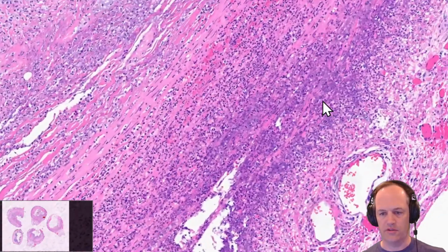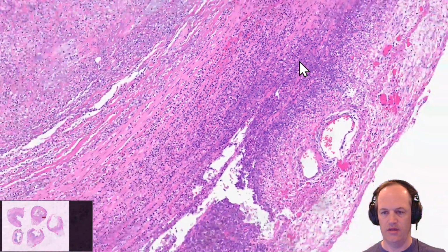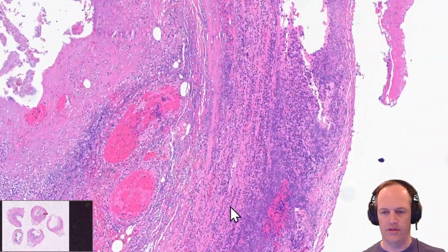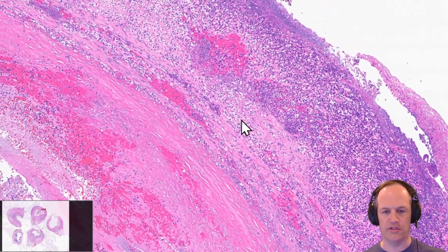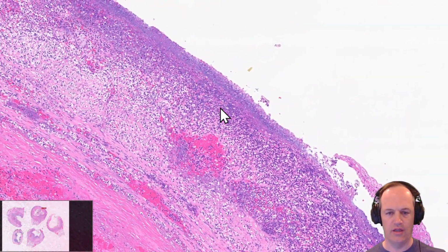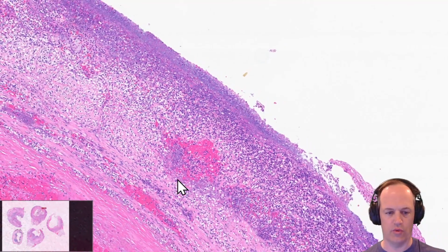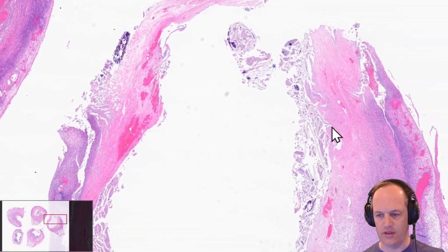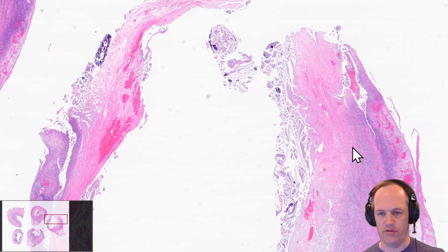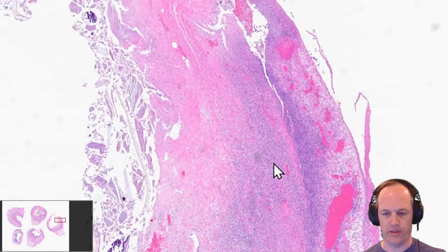And now we're seeing something else. We're seeing this really purple discoloration. Everybody in the chat know what this is? So this purple discoloration is gangrenous necrosis. This is tissue that's dying and liquefying. And you can see it here in the subserosa, you can see it in the muscular wall. And in this example, you can actually see that there's an area of the appendiceal wall that's completely necrotic and broken open. Grossly, this was perforated.